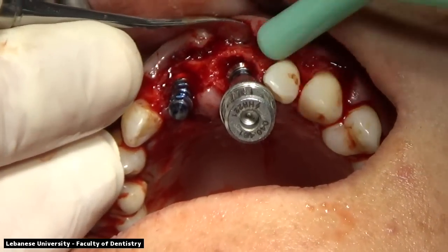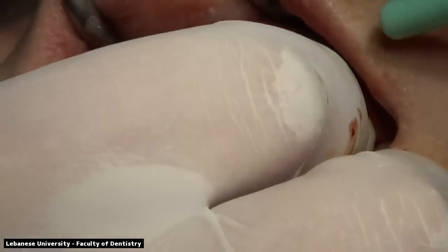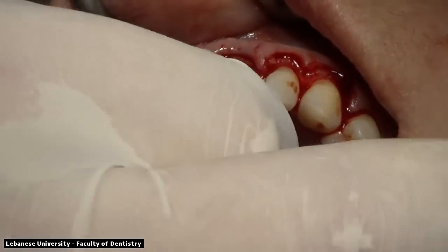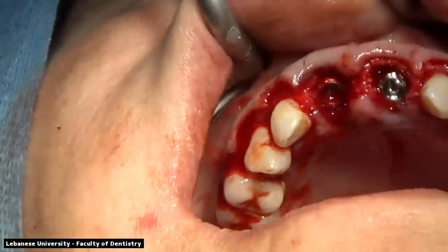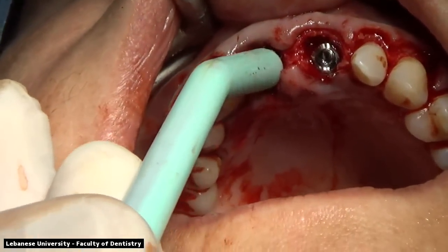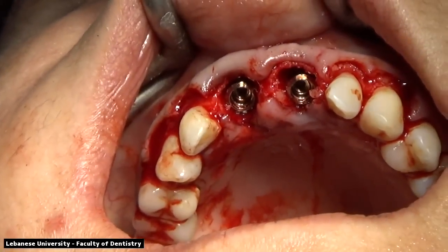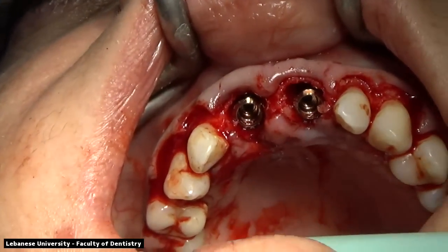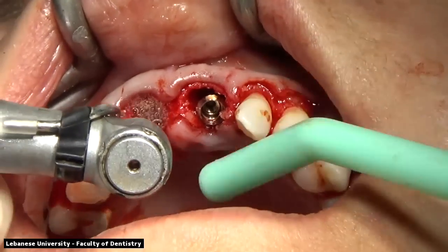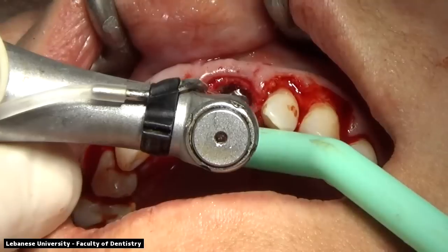We're looking at the buccal aspect and we're seeing that we are at the level where we want it to be. We look at the neighboring cementoenamel junction and we check that it is 2 millimeters away. We remove the mounts of both implants. You can see that both implants are slightly towards the palatal and we have a gap between the implant and the buccal plate of bone. This gap will be filled by bone, by particulate bone.